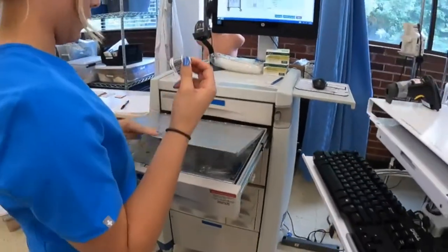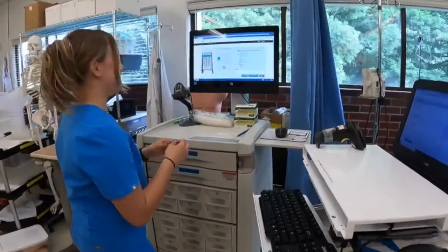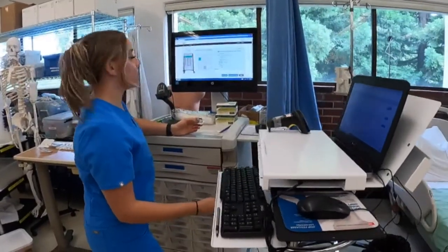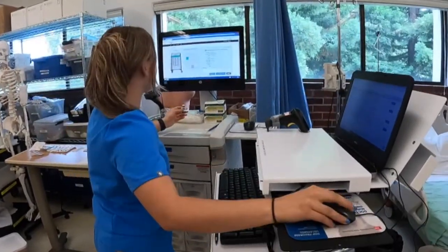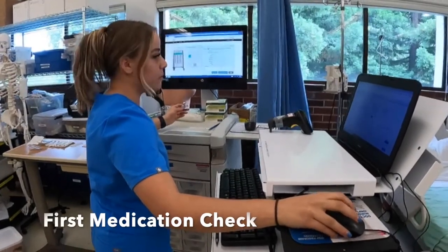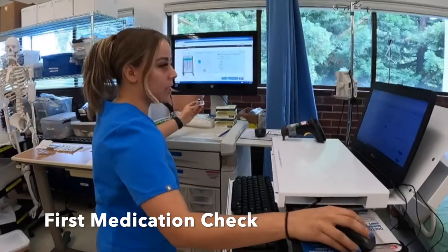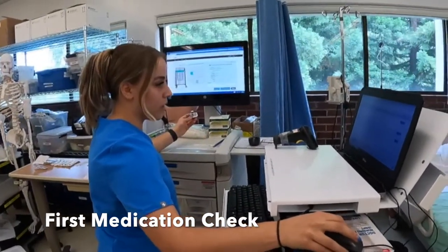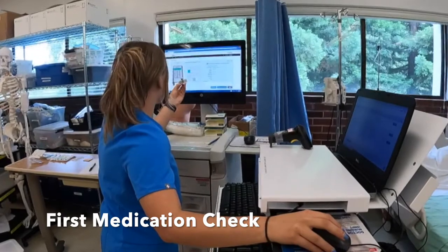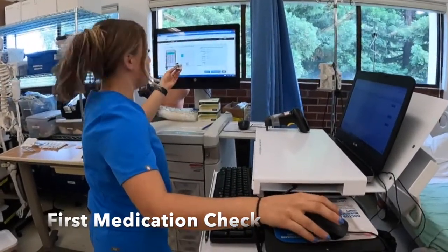I'll pull my medication out. This is where my first check occurs. We're going to verify that this is the correct patient — it's for Morgan Ward, date of birth 6/17/XX. Now I have my medication, and we're going to verify that it's morphine sulfate, two milligrams per two mLs, given IM at 1400.